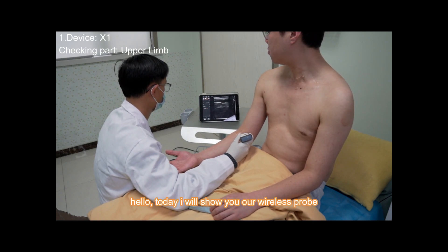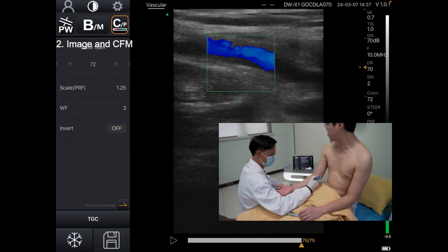Hello, today I will show you our wireless product, named X1, and to check the upper limb.